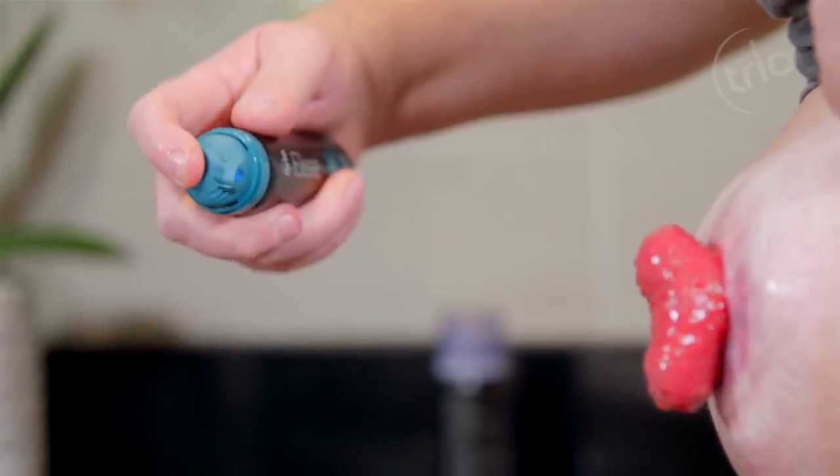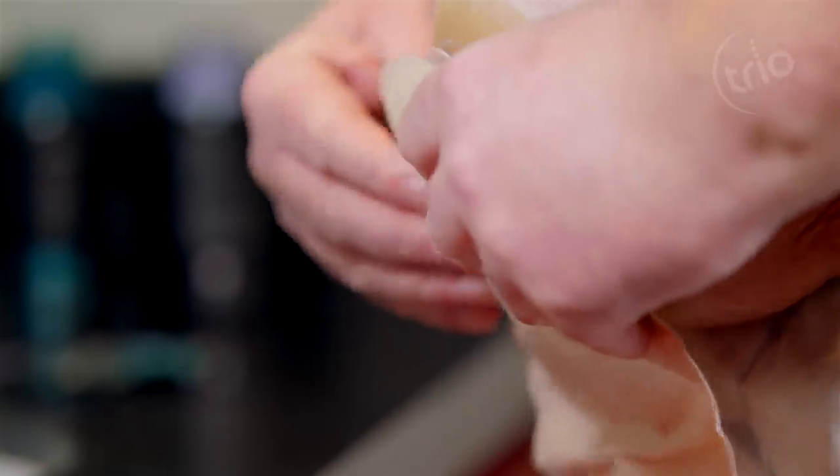Spray Trio Silex Silicone Skin Barrier before you apply your pouch to protect the skin from damage.